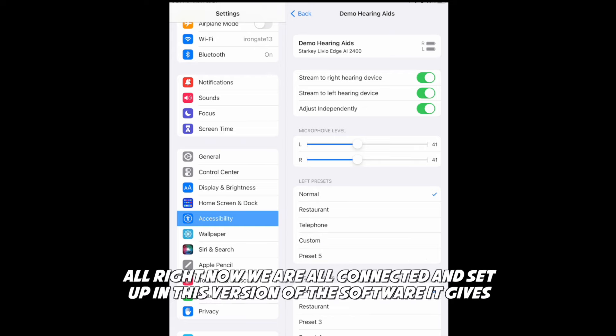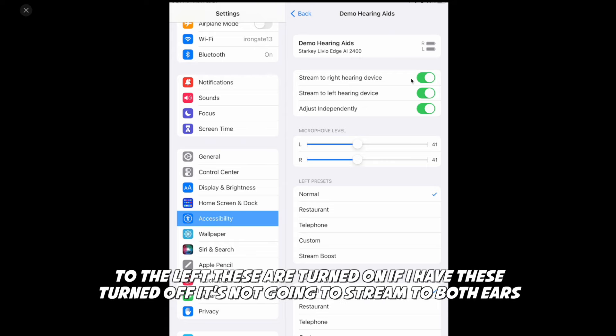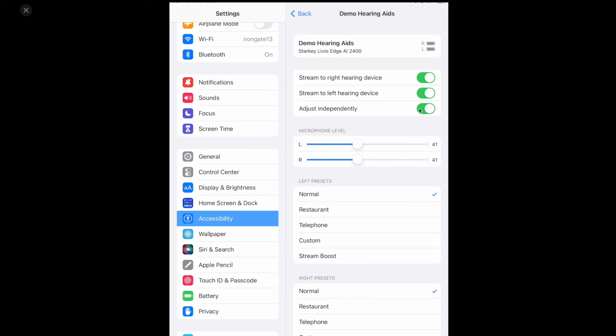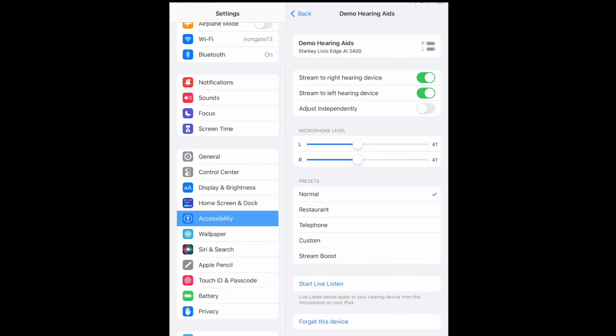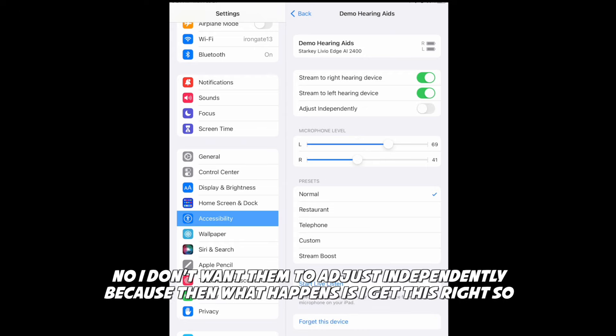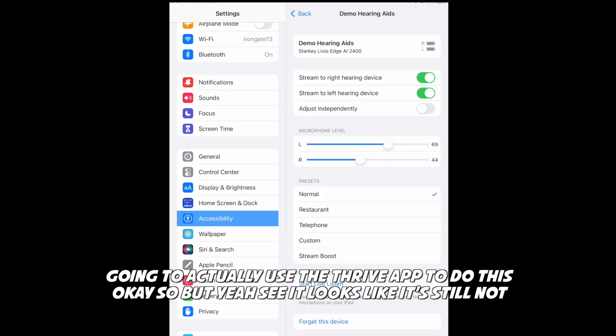Now we are all connected and set up. In this version of the software it gives me a few different options: do I want to stream to the right, do I want to stream to the left? These are turned on — if I had them turned off it's not going to stream to both ears. Right here it says Adjust Independently. I don't want them to adjust independently because then I get an imbalance. You're not going to use the phone settings to change your volume — you're going to use the Thrive app to do this.